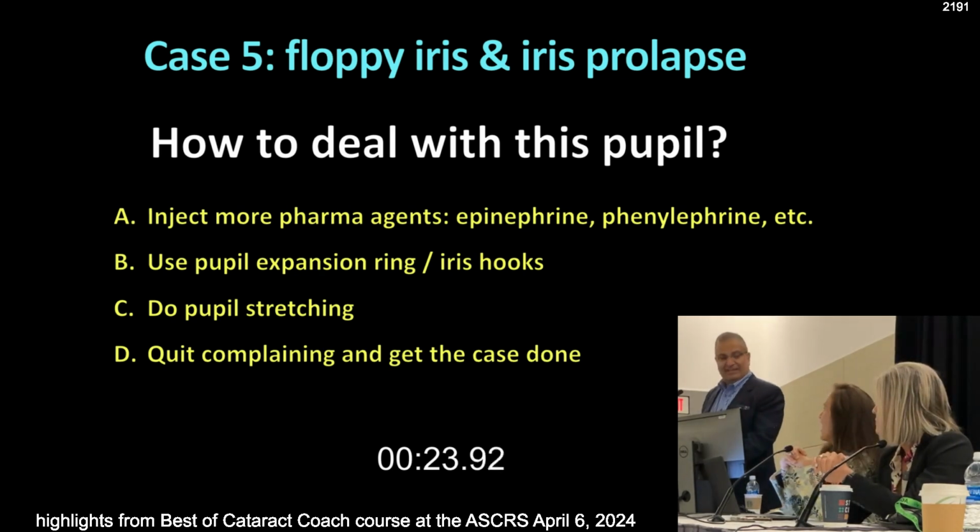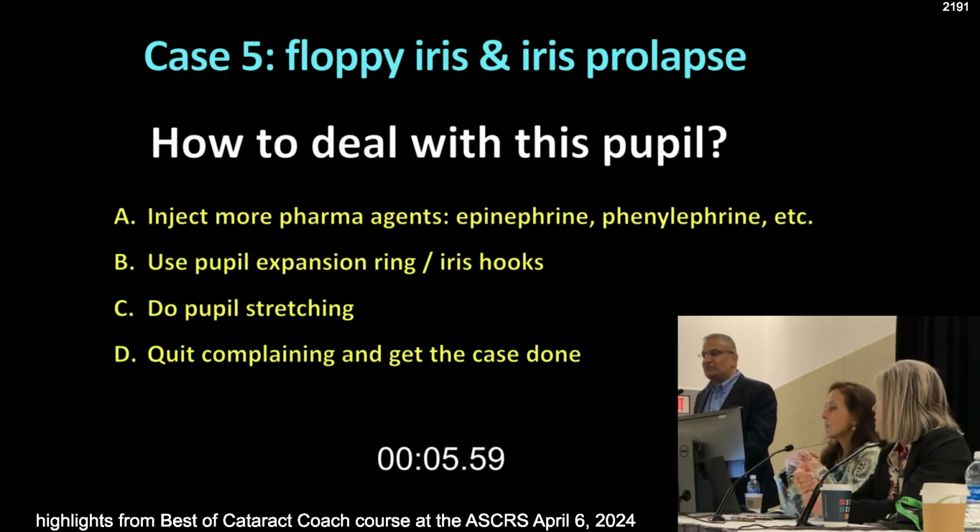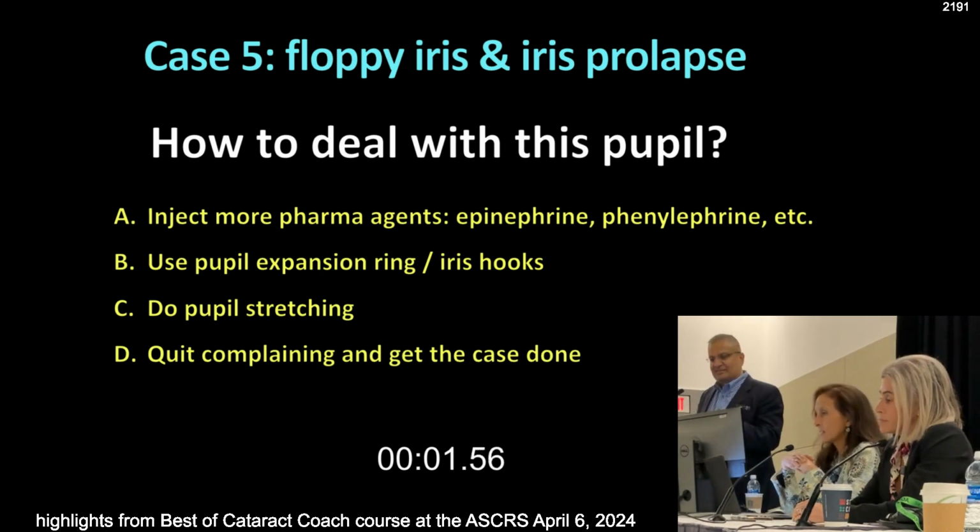That's kind of my feeling too, but I guess it depends on the case. Depends on what the etiology is behind the pupil. Yeah, because if it's a Flomax iris and it's 4mm, it's coming down. Right. If it's a Pseudo-X case and it's 4mm, it's not moving. But then be cognizant and just make sure you know what your zonules are doing. Yeah, I think it's important. For small pupils, Flomax ones are way different than Pseudo-X ones. 100%. Very, very different.